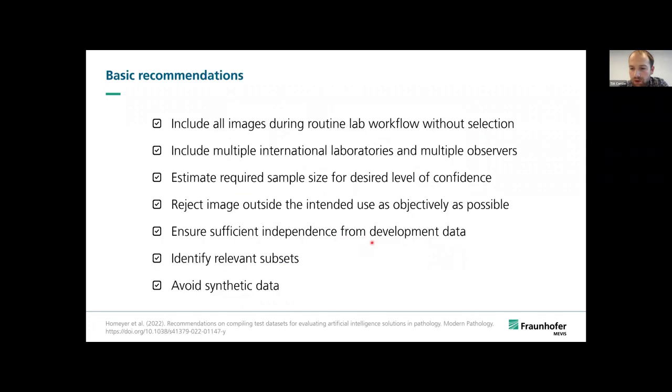The first one was, does the FDA have any requirements at all on minimum accuracy or sensitivity or specificity, for instance? Not that I'm aware of. Generally, you won't find any numbers in these recommendations, no 0.9 something or anything like that. Or what would also be great is if the FDA or the EU said how many images, even a certain dimension of images, that you should consider for evaluating AI solutions.